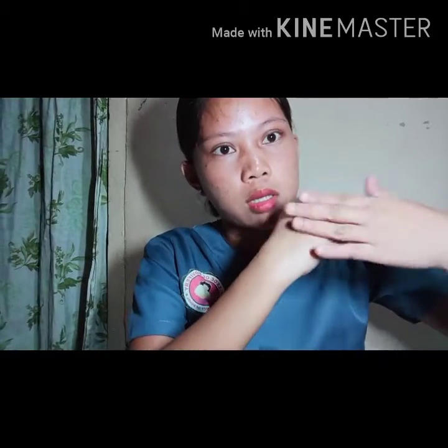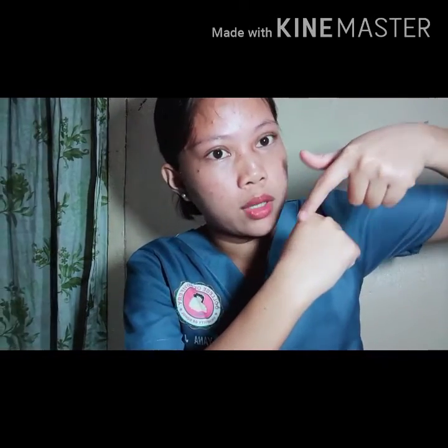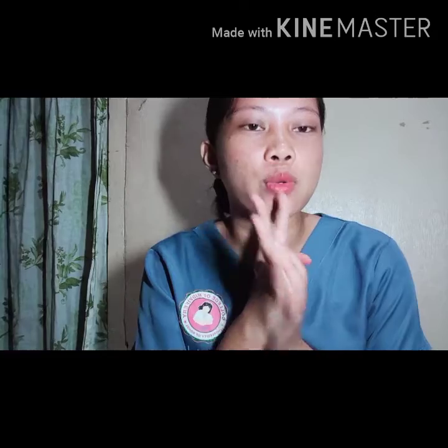After ka nag-initiate og infusion, you must take the catheter para mas kuan siya kanang di na siya matandog-tandog. Take the catheter by the U method. So imoon is U nga method kung matake ka sa catheter. Next is, after nimo nga tape ang catheter, you dress and label the puncture site and tubing according to agency policy.